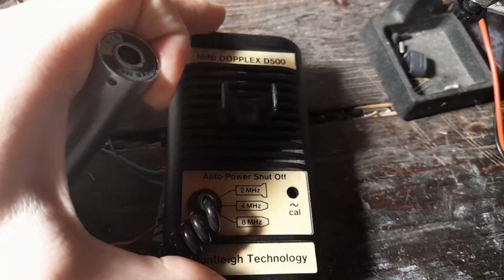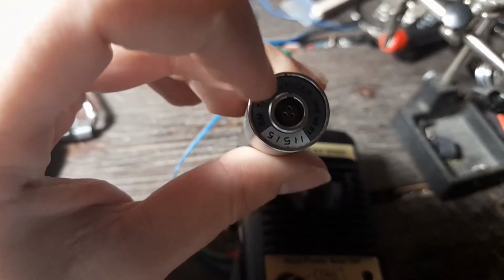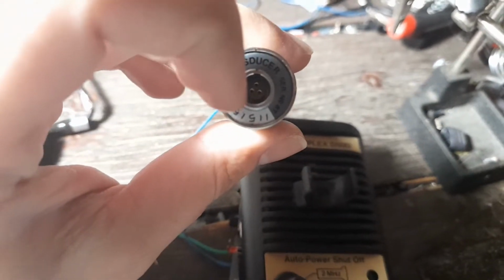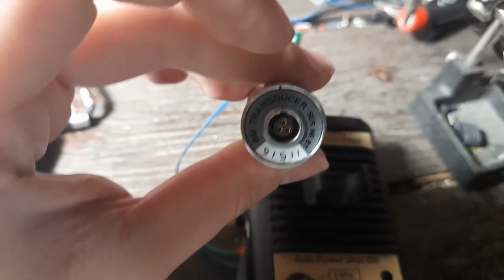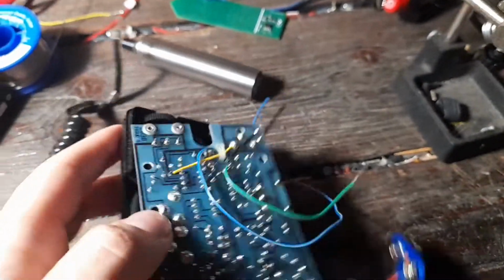First, I decided to test the speaker unit by itself. First, I traced out this connection. It has 3 connections. I assume that one is for the audio signal, and the other 2 are for power, ground and VCC. Of course, the ground and the power connections are easy to trace.